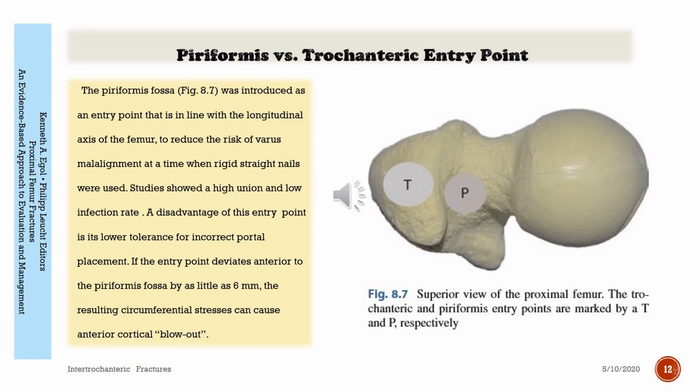Mostly in our times, the trochanteric entry point is usually preferable for surgeons. Also, devices are very available for the trochanteric entry point. The piriformis fossa has its merits and demerits.